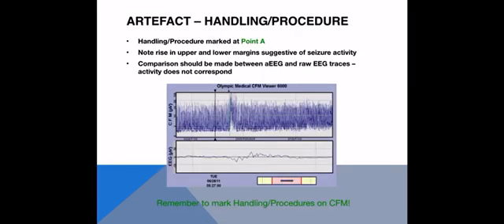Looking at this trace, without the marker — the green line — you might think the baby had a seizure, as the baseline and upper limit have both risen at point A. But when we compare that with the raw EEG at the bottom, it doesn't correlate; we can't see the spike or rhythmical pattern there. This highlights the importance of adding markers for procedures and interventions.